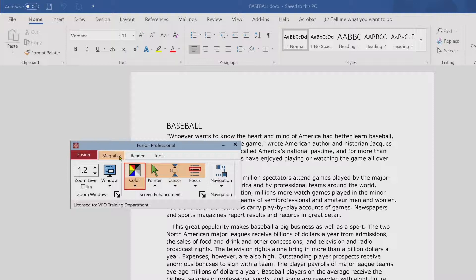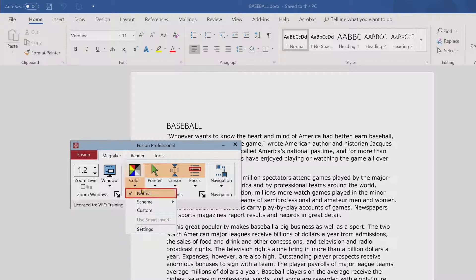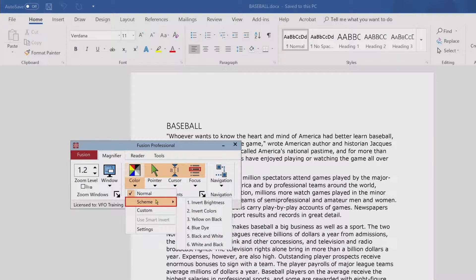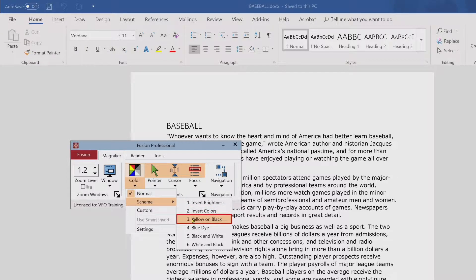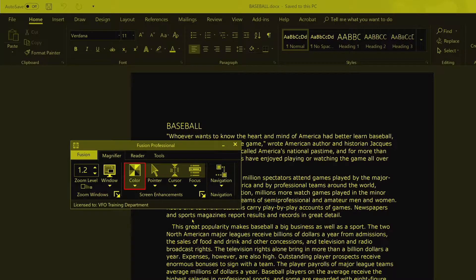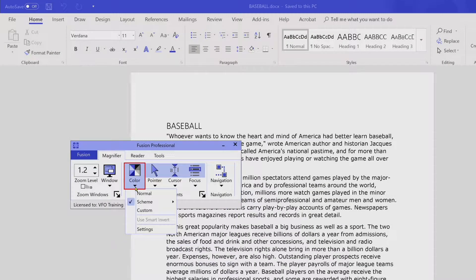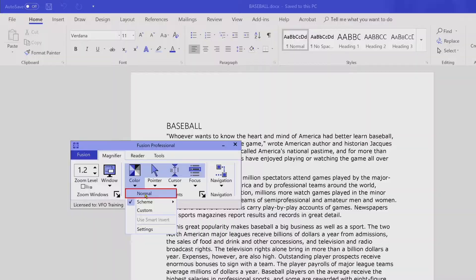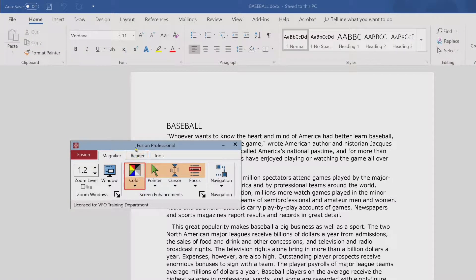To choose a preset color scheme, on the magnifier toolbar tab, click the arrow next to color, and in the color menu, choose scheme submenu. In the scheme submenu, choose the desired color scheme. Color button checked, menu, normal checked. Screen enhancements enabled, screen enhancements group. Fusion professional, title bar.